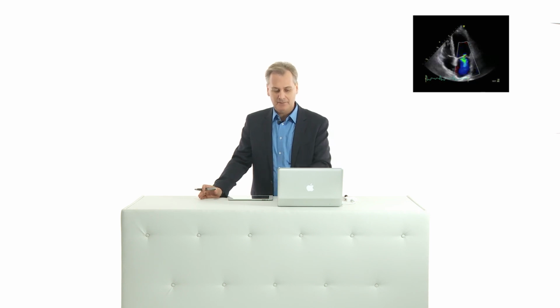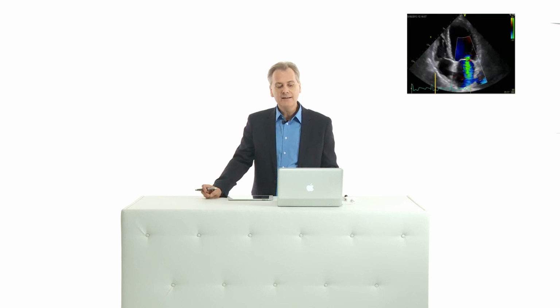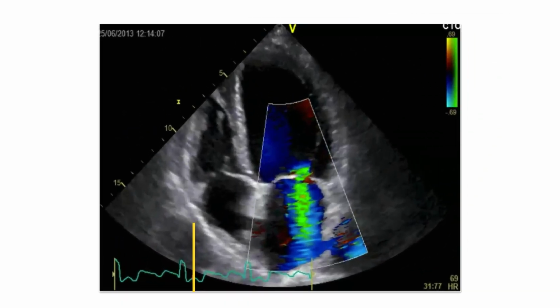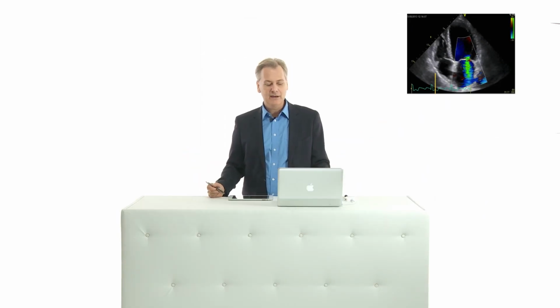With echocardiography and with visualizing the jet, we can get a lot of information. I'm freezing the image now during systole, and right at that instant, we have mitral regurgitation. You see the jet right here from the left ventricle into the left atrium during systole. So what else should it be? It must be mitral regurgitation.